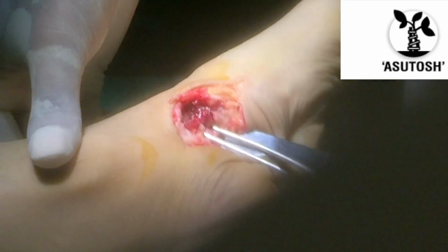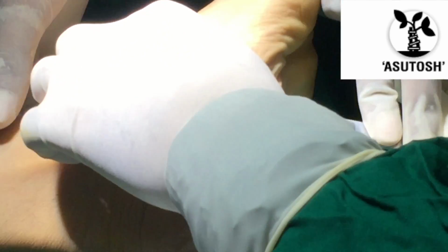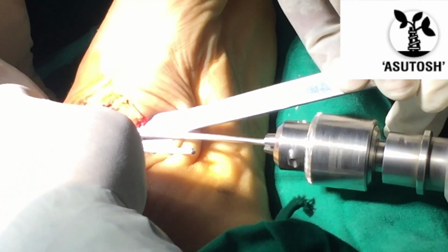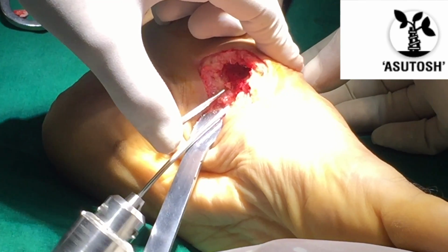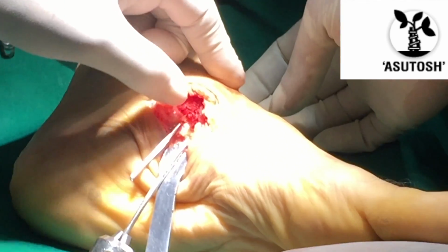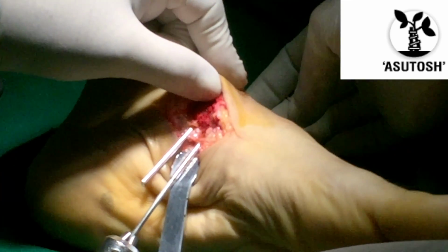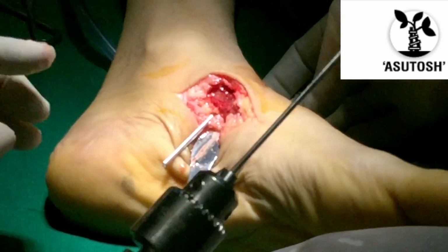People may just keep the accessory navicular and use it to make drill holes into the navicular. However, the mechanical strain would still persist after the surgery. So it is a difficult thing right now to drill the holes.